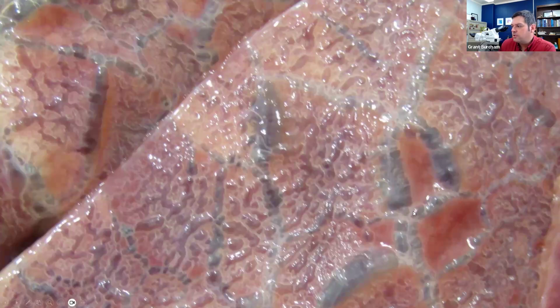And if you get a little bit closer, here are those pink areas again, and you can see that those white areas are actually air. And so there should be air in the lung, right? But it should be within the air sacs. And whenever you see air that's outside of those air sacs, which would be the pink area, that's emphysema. So this is emphysema within this heifer's lungs. So that's air that's outside of where it normally should be in the lung.